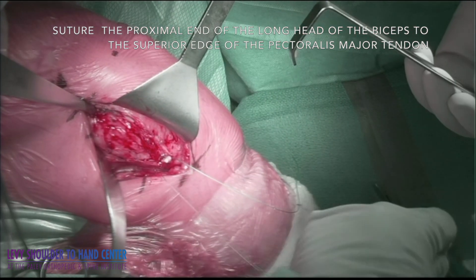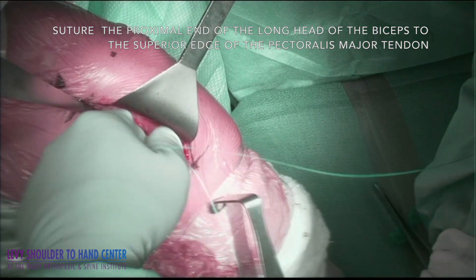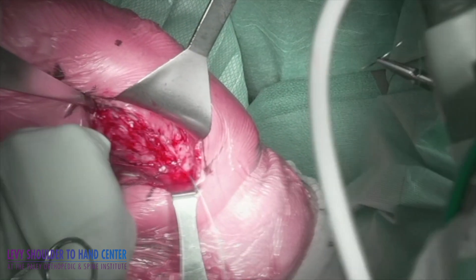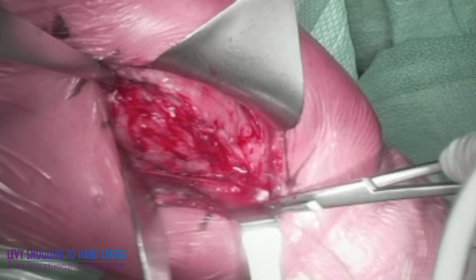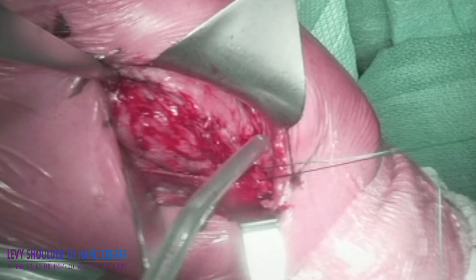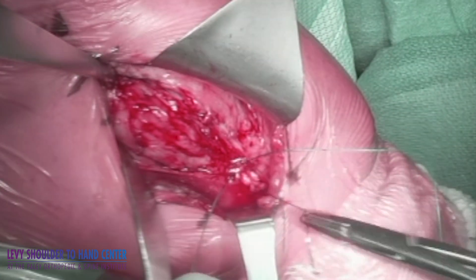The pectoralis major is then exposed by placing an army navy retractor, pulling anteriorly, allowing the biceps to come under and then over. I start the suture two centimeters distal in the pectoralis major, and as you pull the sutures taut, the tendon overlays on top of itself, creating a sandwich.